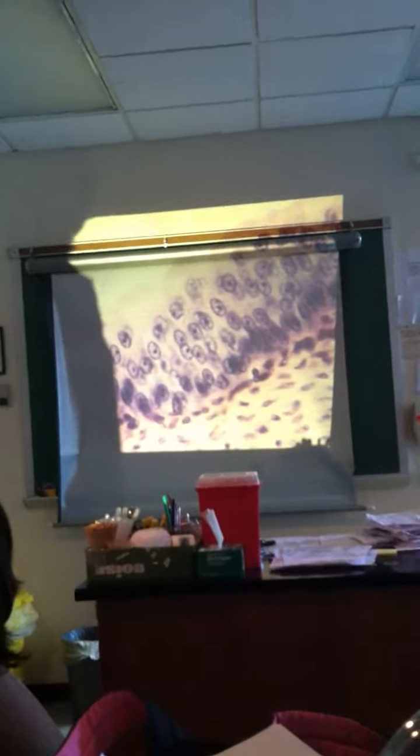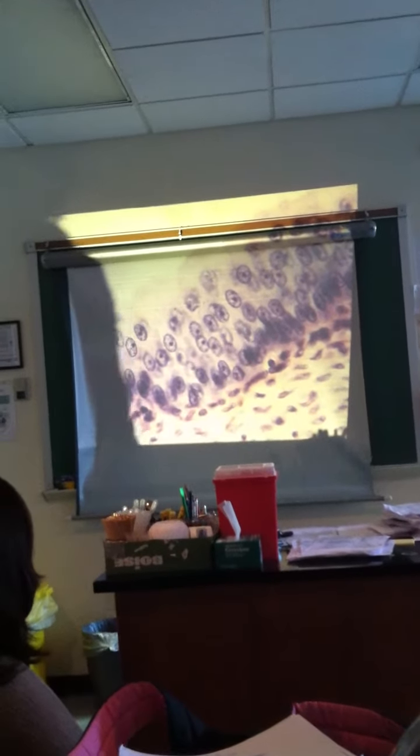Transitional epithelium in the relaxed state. And you don't have to say in the relaxed state, but that's what it is: transitional epithelium. But you've got to be able to see the membranes.